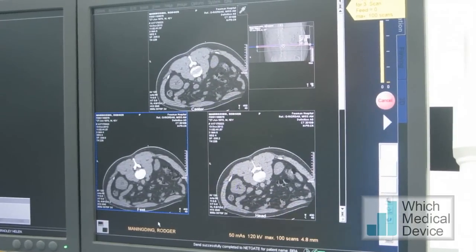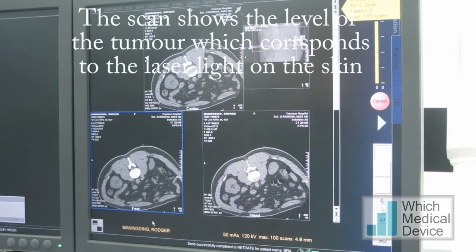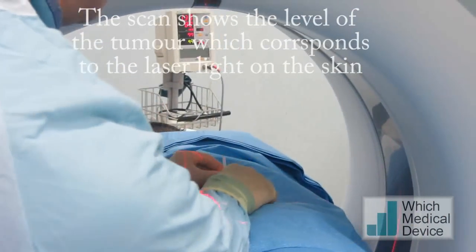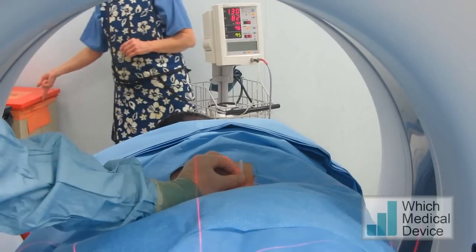The most inferior slice just shows the small renal tumour on the bottom left of the screen. So we know that's the slice, we're just going to make a mark on the skin. Just pressing onto your skin now, and that's where we're going to be putting our local anaesthetic.